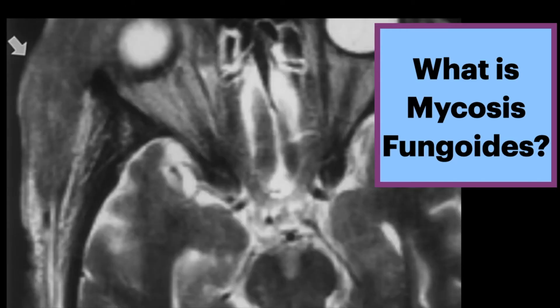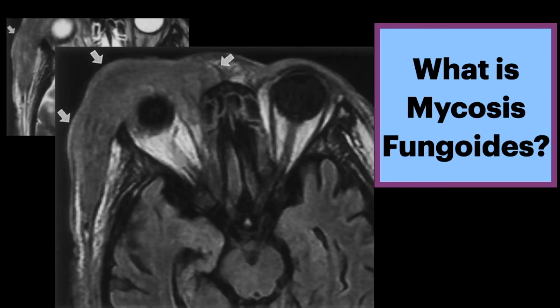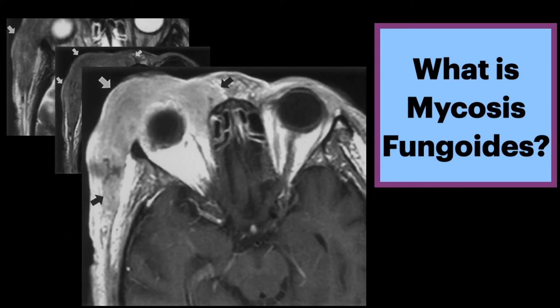In this other case of orbital involvement, a middle-aged female presents with a large tumor involving the right upper eyelid. This mass has low signal intensity involving the skin and subcutaneous tissues. T1-weighted imaging shows intermediate signal intensity, and contrast-enhanced imaging shows diffuse marked enhancement.